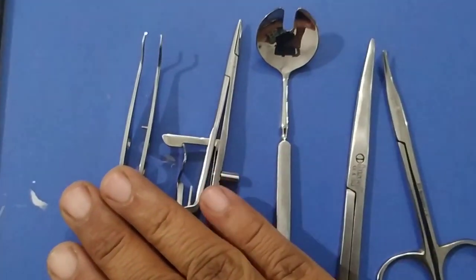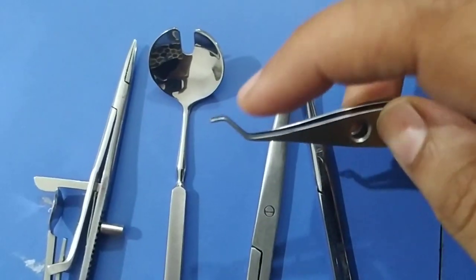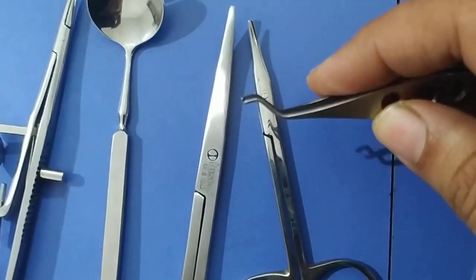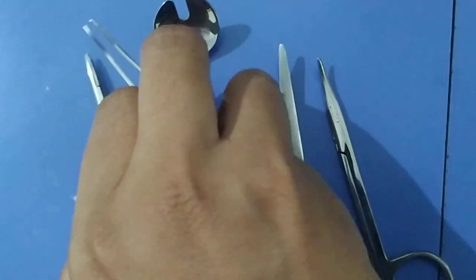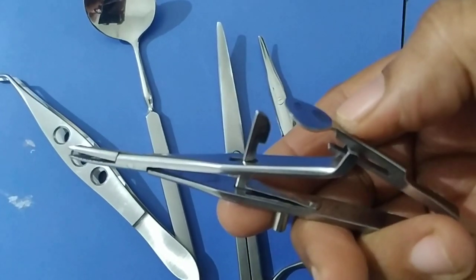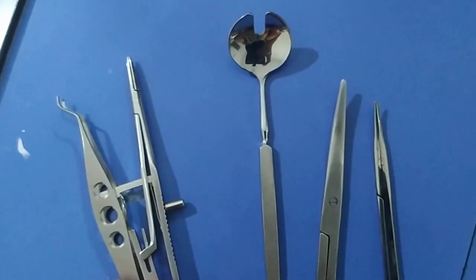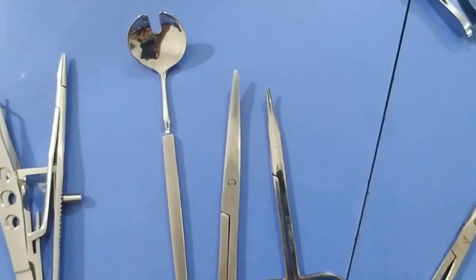This is a superior rectus forceps. It is a bit stout, has a double edge — one cuff here and another cuff here — and it has a 1x2 tooth. It is always used with the Aruga's needle holder. This is the thumb rest, and this is how you open and close the instrument. Superior rectus forceps, along with the needle holder, is used to take the superior rectus bridle suture to stabilize the globe during cataract surgery.